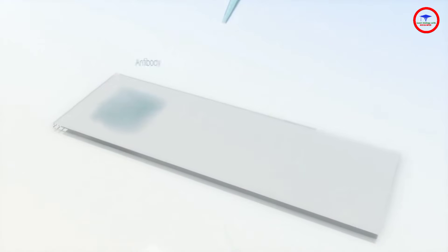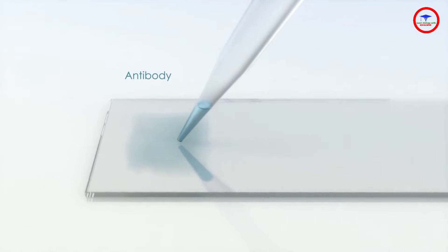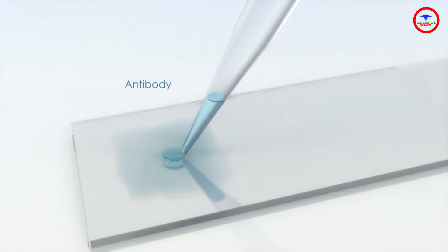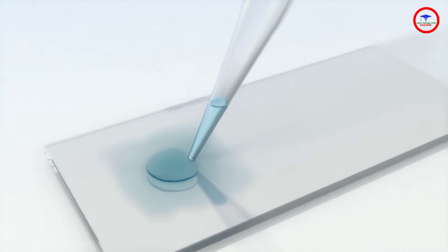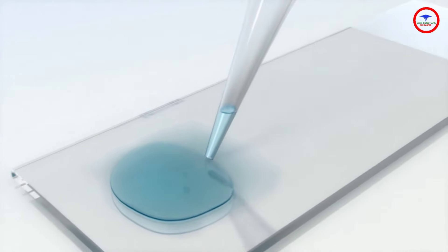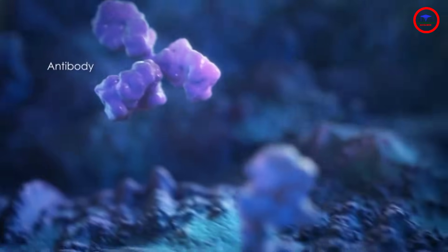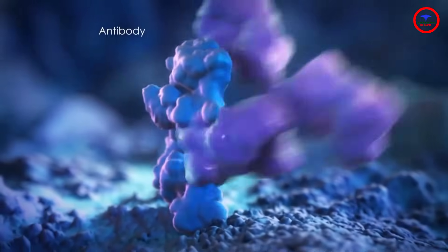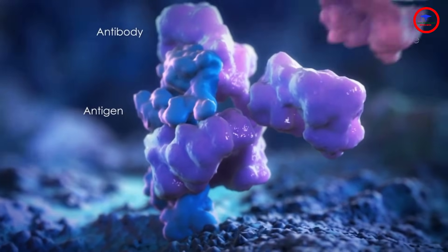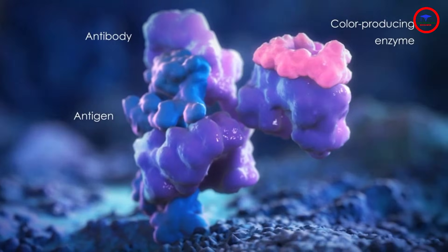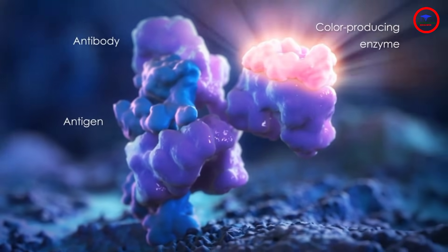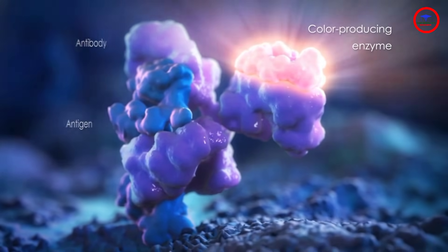IHC uses the same antibody-antigen interaction to detect target antigens in patient specimens. A thin slice of the specimen is first adhered onto a microscope slide, and then antibodies that recognize a specific antigen are added to the sample. If the antigen is present in the patient sample, then the antibody-antigen interaction can be detected by using a color-producing enzyme.